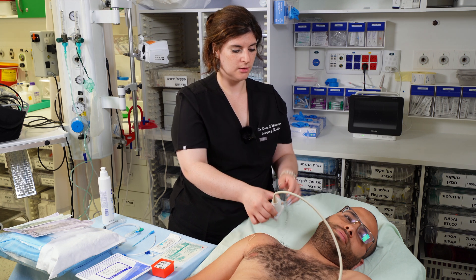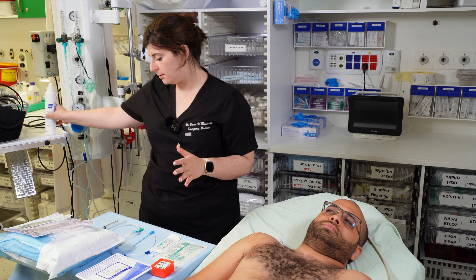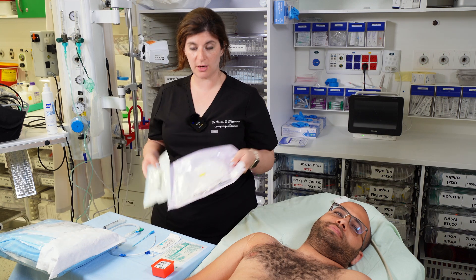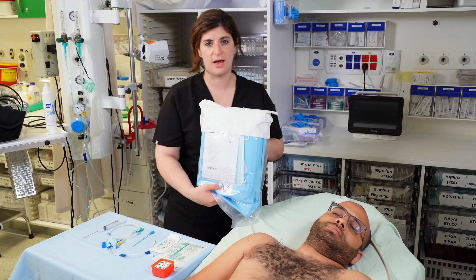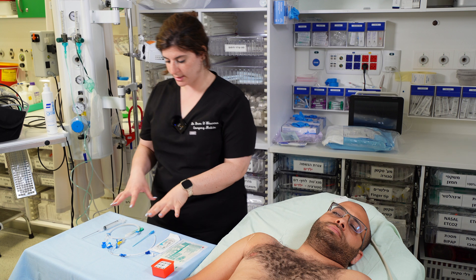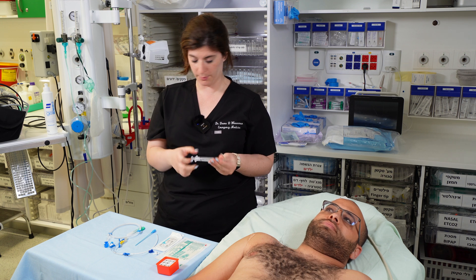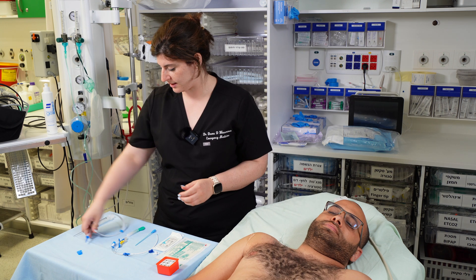Once you have your vein and the anatomy is acceptable, put the ultrasound down and set up your equipment. You'll need a central line kit — seven French, 20 centimeters, triple lumen — a sterile probe cover and gel for the ultrasound, and a sterile bundle for drapes, caps, and extra supplies. Set up equipment in the order you'll need it: start with your needle and syringe already attached, bevel up facing the numbers, then your wire.